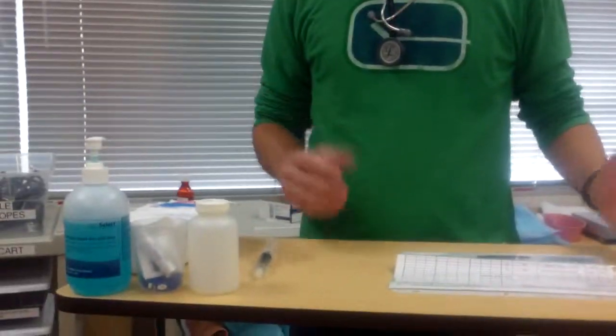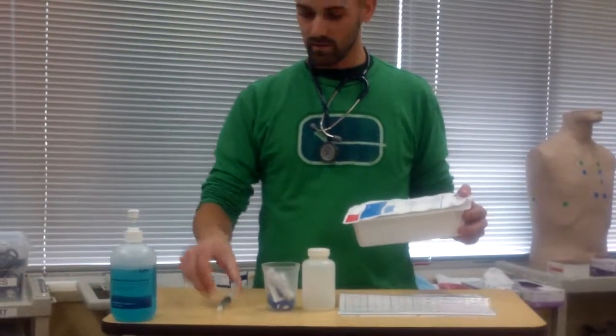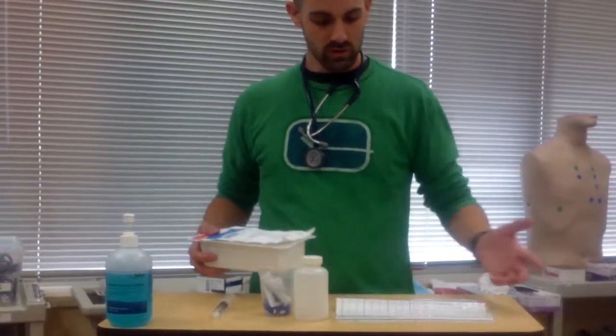And now I'm ready to go to my patient's room. First I need to gather a few more supplies. So I got my irrigation tray. I'm going to check all my supplies. Get them all. Make sure the integrity is good. The expiration date is not expired. Everything is valid. Everything is good. So now once I have all of that, I'm going to go to my patient's room.